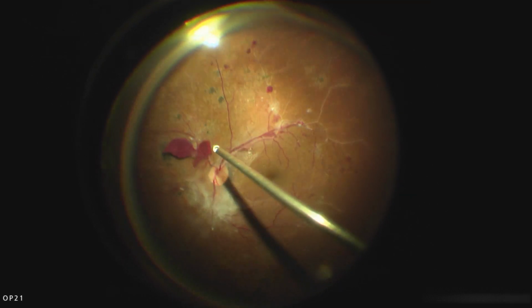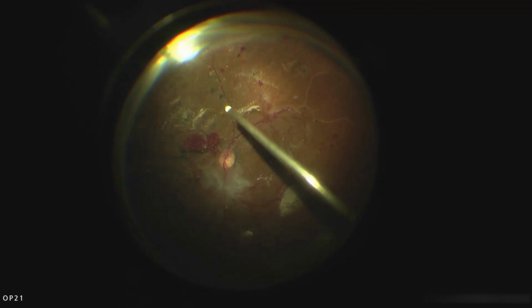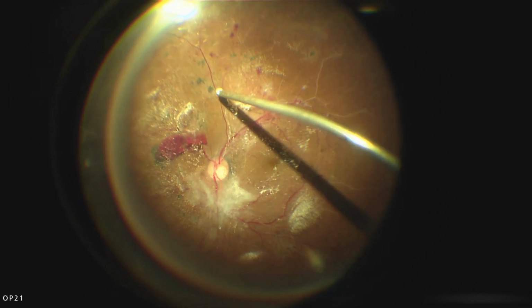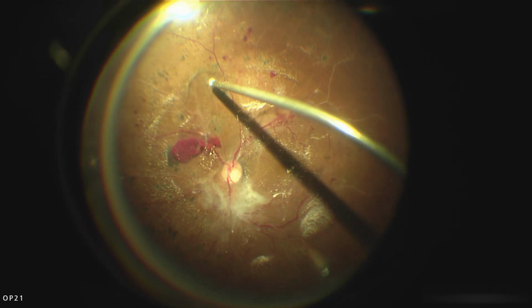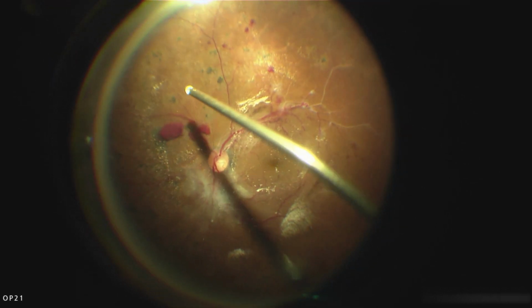This is quite a straightforward case, not a complicated case at all, but it's important to know how to deal with cases where the posterior hyaloid is completely attached. So the first thing I do is a slight core vitrectomy and then try to find any area where the vitreous is detached. In this case, there wasn't, so I used triamcinolone in order to visualize the posterior hyaloid slightly better.